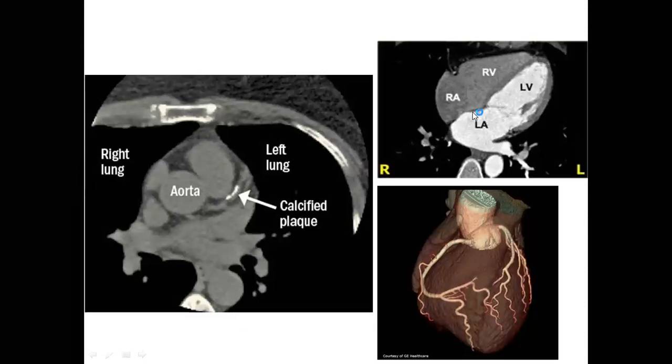So this is how it will look like on CT scan, and in the left heart we are able to see this X-ray positive contrast right here, and you are seeing the smallest defect in the filling in the cavity of the left ventricle. So in this case we may suspect some left ventricular myocardial infarction. This is in the projection of this plaque. So we may suspect this type of pathology.